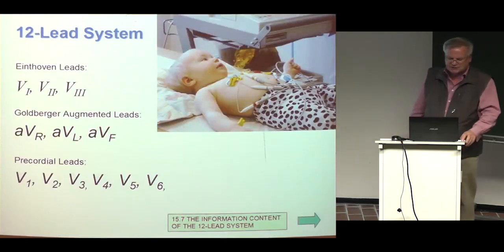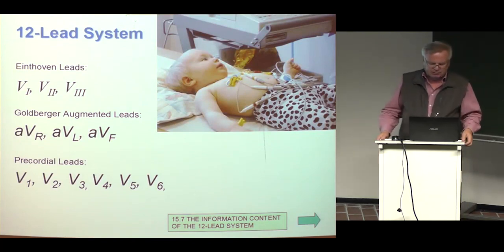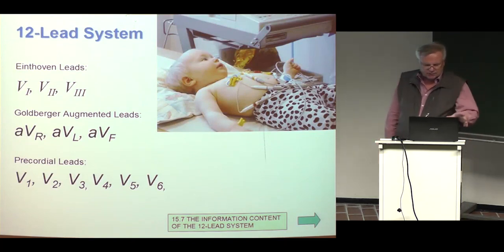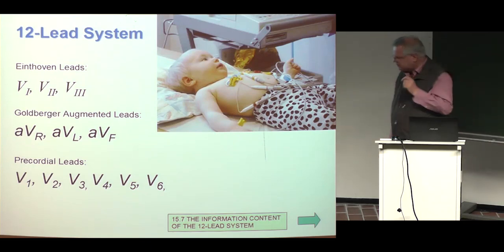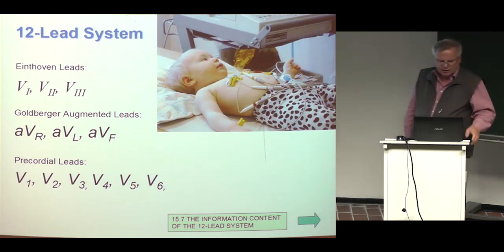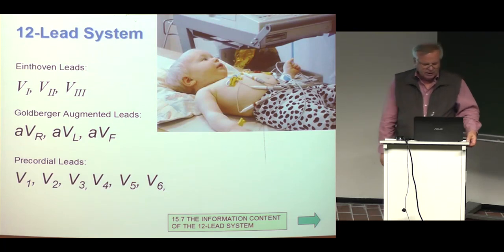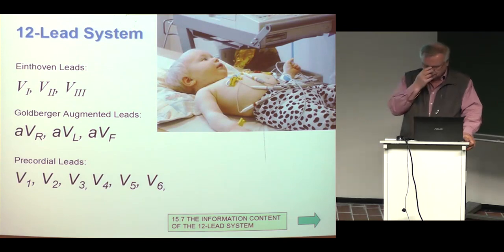Okay, here is finally now the 12-lead system. I repeat, Einthoven limb leads, I, II, III. Goldberger augmented leads, which are amplified or more sensitive Wilson leads, aVR, aVL, aVF, and precordial leads, V1 to V6. Augmented means amplified. Therefore, there is a small a.